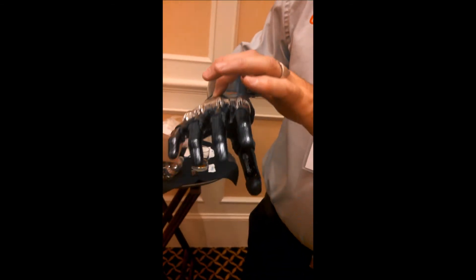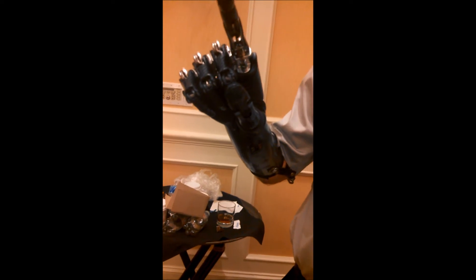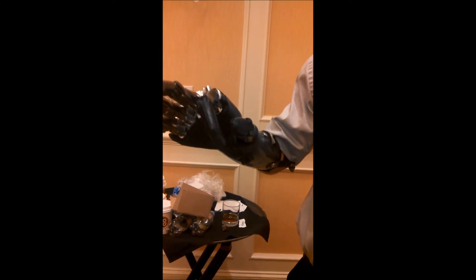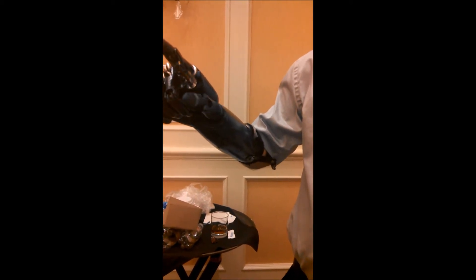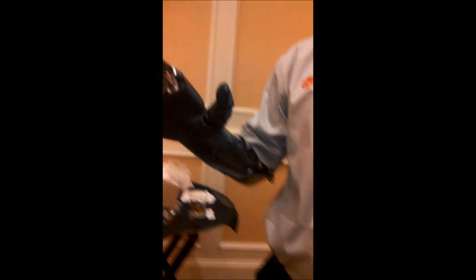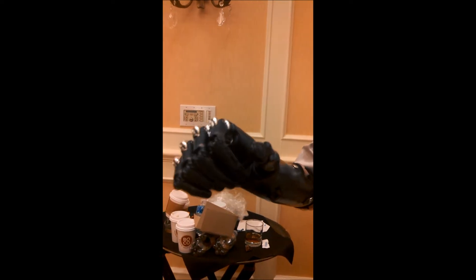If I touch the switch on the back of the hand, I've got my precision pinch. Another open signal — index point. Then I can move the thumb to the unopposed position, and from there I've got a mouse grip. Trigger grip for using like a spray bottle. And that's just coming off those two electrodes with my simple open-close EMG signals. And here we have the key grip.